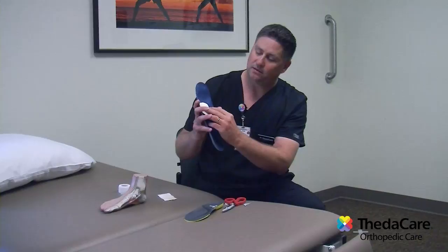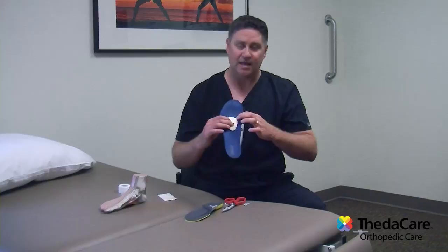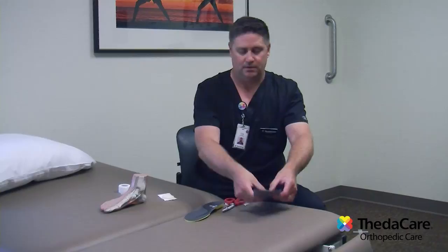Position it so that the point is pointing directly to the middle of the heel, and the rounded part at the top sits just on the edge of that worn-out area where your metatarsals are. Once you find the spot, tape it in to your shoe insole — I would use duct tape or a really sticky tape — and place it right in the area just like that.